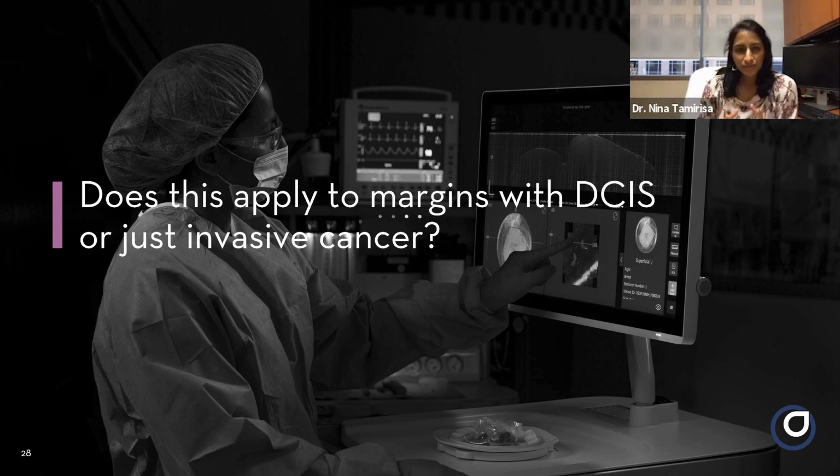And where it gets tricky with DCIS is non-calcified DCIS that may not be seen on mammography as well, and then we get the pathology result and it shows DCIS in the margin. That's kind of the most frequent case that we encounter. But here, as you can see, again, you can clearly identify where DCIS is close to the margins to be able to decide where you want to take directed extra margins at the time of the surgery.